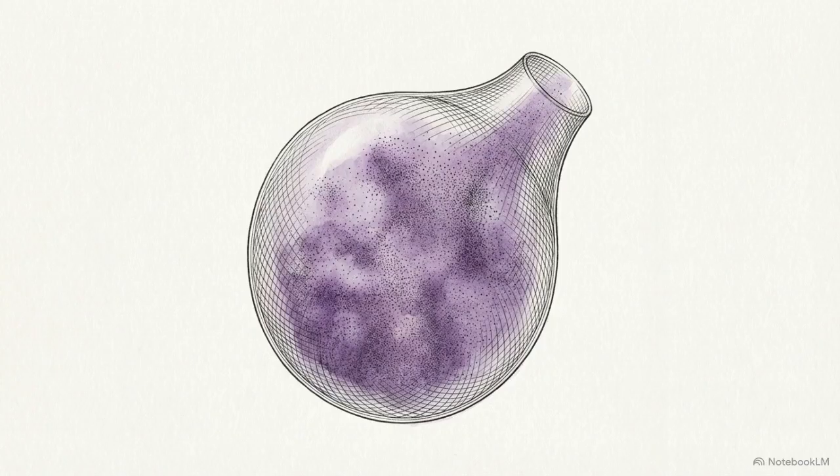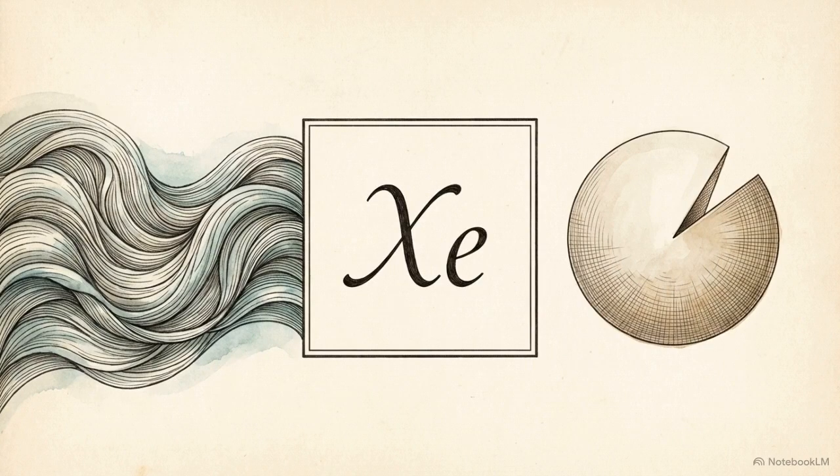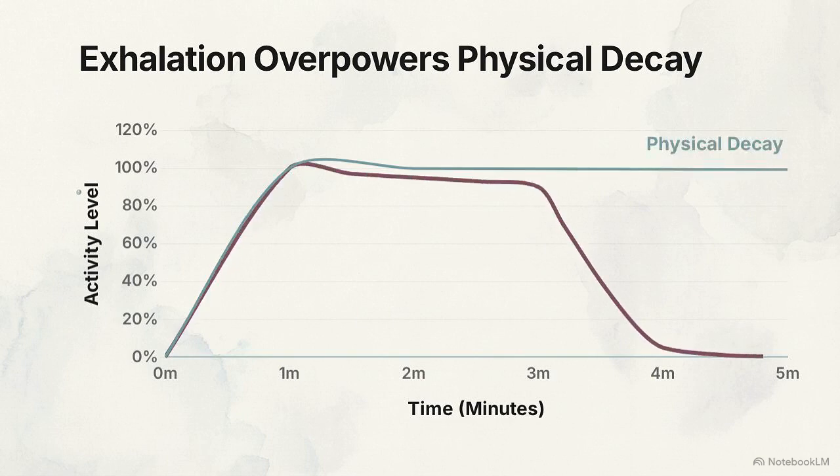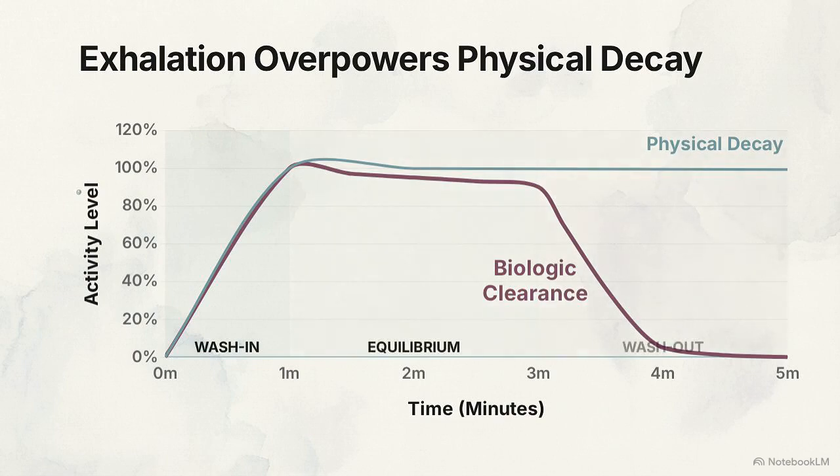To evaluate the ventilation phase of the lung, we abandon mechanical trapping and switch to compartmental containment using a radioactive gas, Xenon-133. Xenon-133 possesses two key physical properties. It emits a low energy of 81 kiloelectron volts and has a physical half-life of 5.3 days. This graph plots xenon's slow physical decay against its sharply dropping biologic half-life, as the patient simply exhales the gas. This rapid clearance forces a highly compressed timeline, divided into three rapid blocks: wash-in, equilibrium, and wash-out.